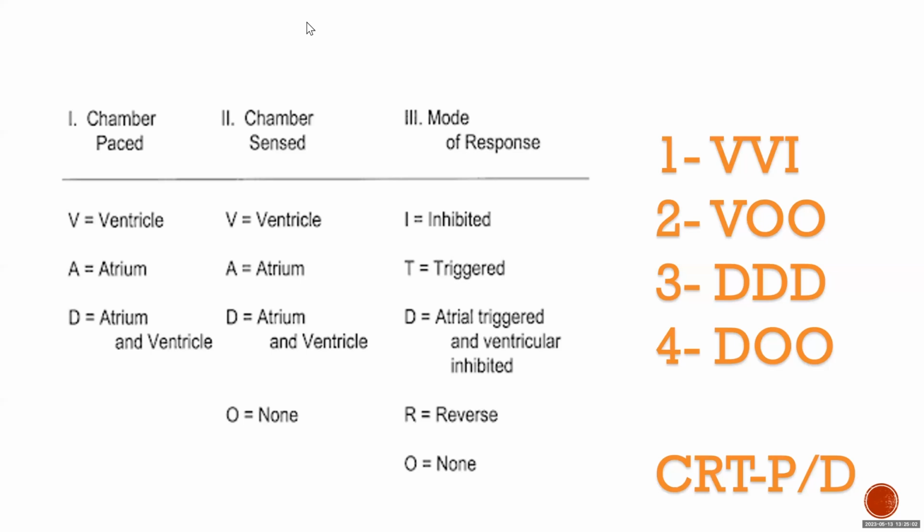But a 50-year-old post-TAVI with diastolic dysfunction, LVH, high filling pressures, normal EF, with heart block, you're probably going to implant dual because you think they will need the atrial kick. So it's a clinical judgment.